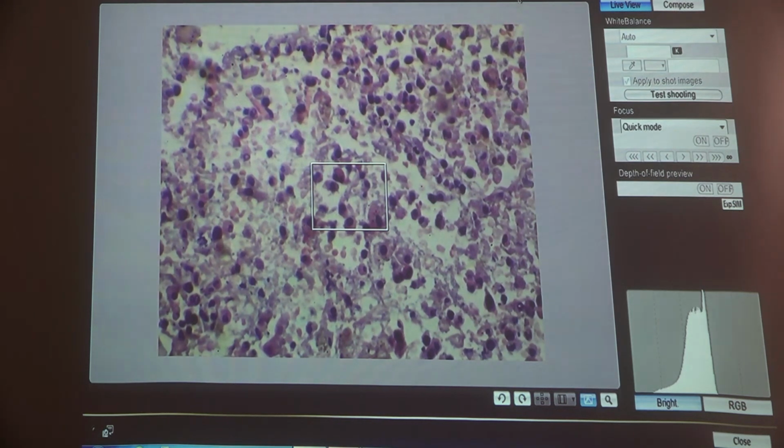This is gray hepatization of the lung tissue. This is neutrophil. This is histiocytes. And somehow this is RBCs, few RBCs, and the alveolar wall is also congested.